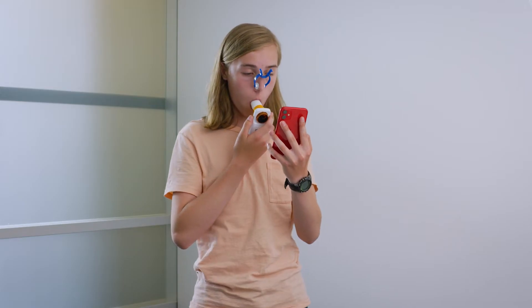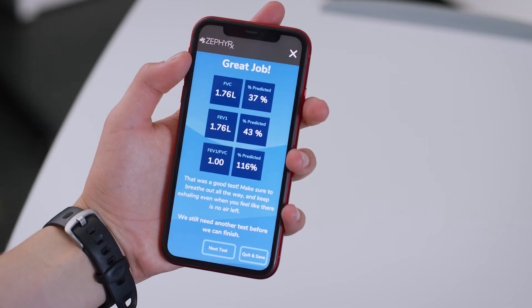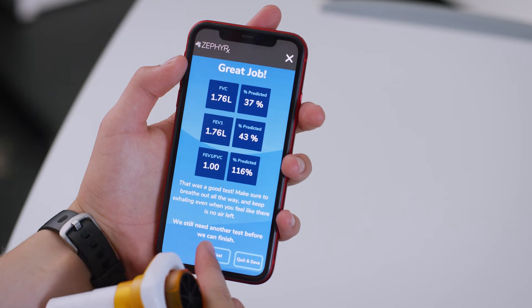With your mouth still on the mouthpiece, take another breath in. And you're done. If you mess up — start it too soon, cough in the middle — don't worry. The app will not count that test.